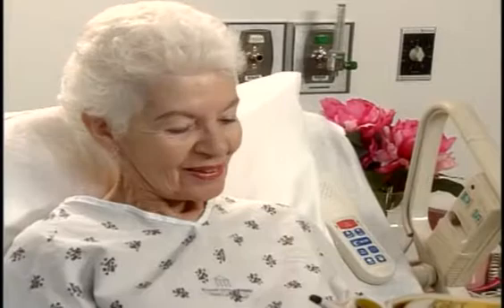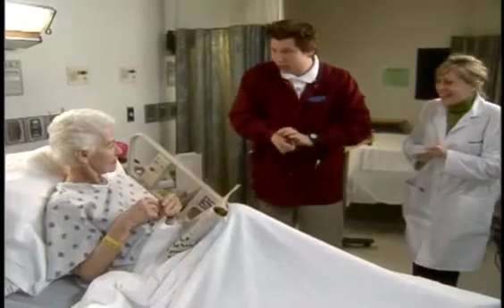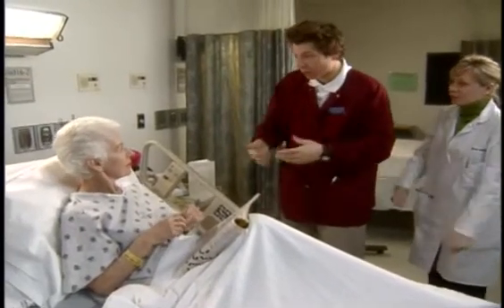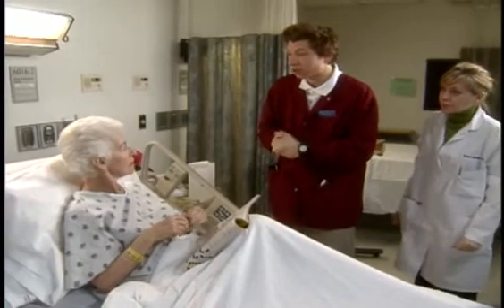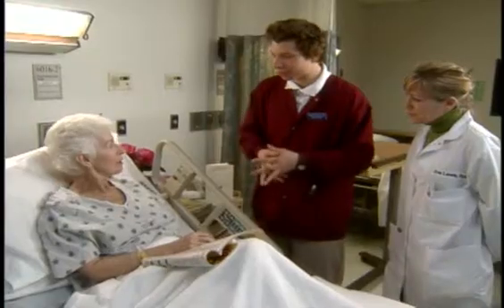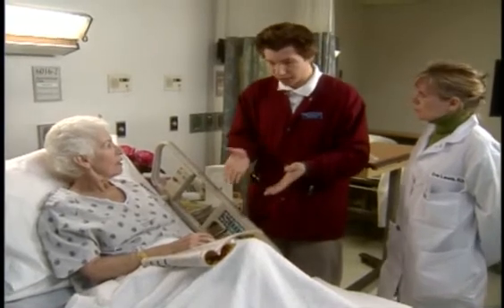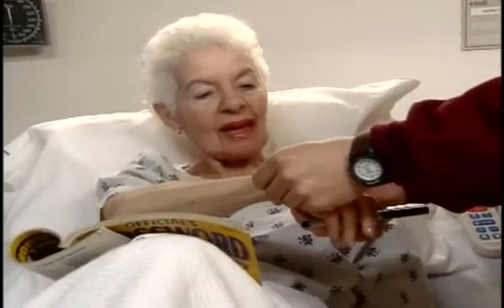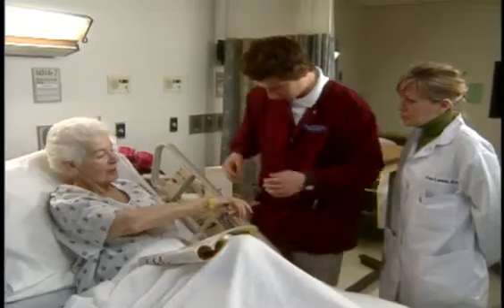Hello, Mrs. Keene. Hello. Hi. This is my nursing instructor, Miss Lewis, and she'll be working with me today. Okay. Okay, now your doctor wants to give you oxygen to help you breathe better, and it's given in something called a nasal cannula. And it's a soft plastic tube that fits into your nose. Can we put it on? Oh, yeah, I've seen those on TV. Yes, they are. They're really quite common. Do you mind if I take a look at your ID bracelet? Sure. Thank you. And can you tell me your full name? Yeah, it's Alice Keene. Okay, thank you.